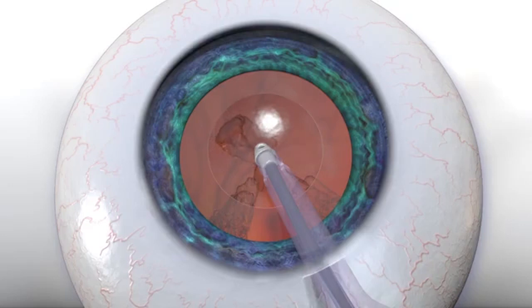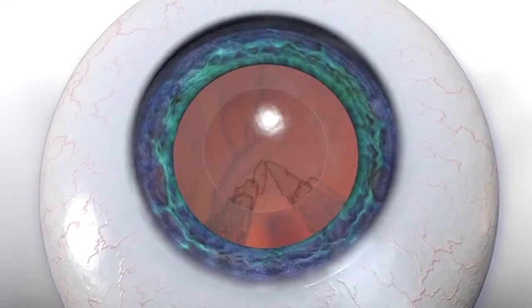Cortical material is accessible for the majority of clock hours, but sometimes the sub-incisional cortex can be difficult to rapidly remove.